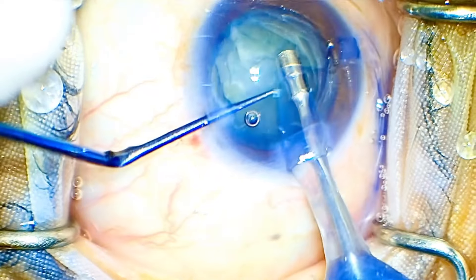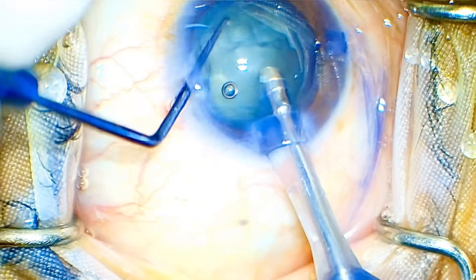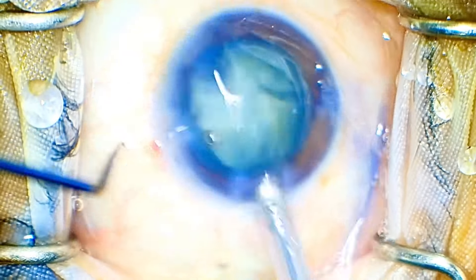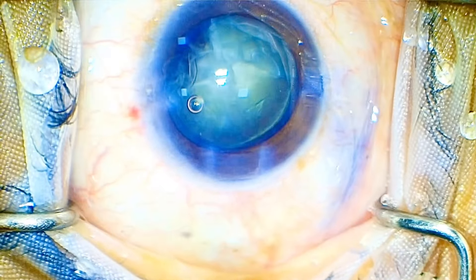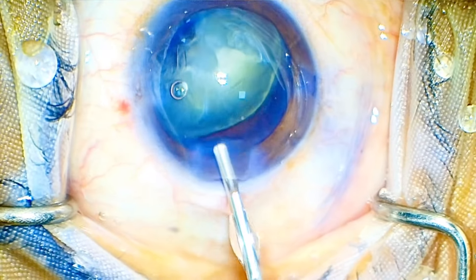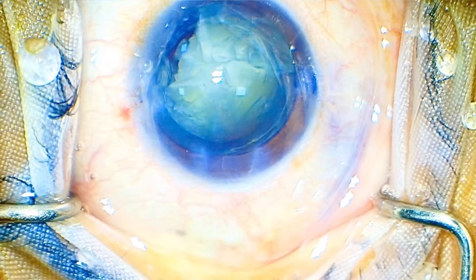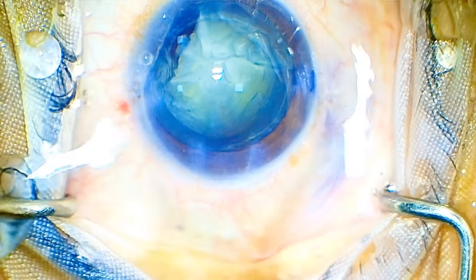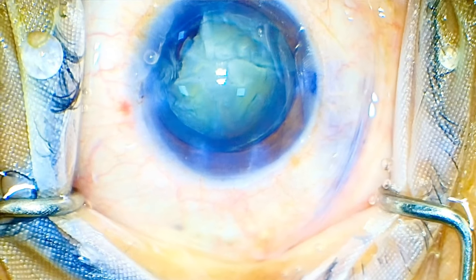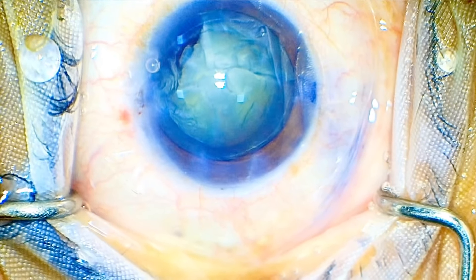At this point I noticed two things: my inadequate tip exposure, and the FACO is not working according to my demand and need. I am keeping the FACO pedal at position three, but the FACO has stopped pulling the way it used to — I felt something strange. When I looked at the peristaltic pump on the Oertli Swiss Tech machine, I noticed something strange: the wheel was having a jerky movement, due to which I was not able to grab this quadrant and pull it off.